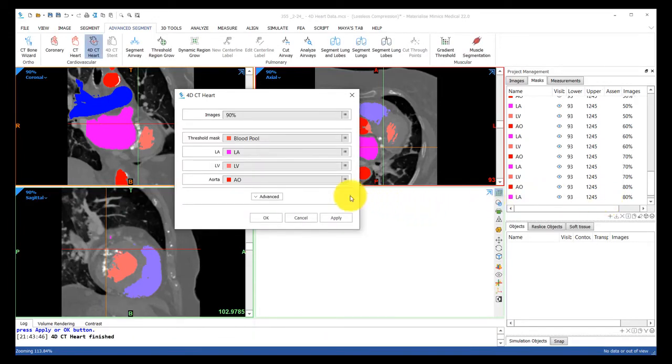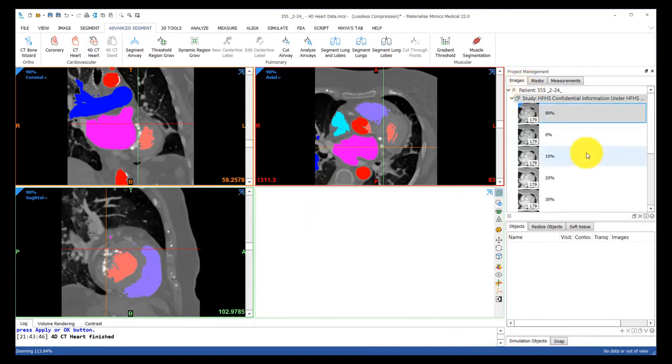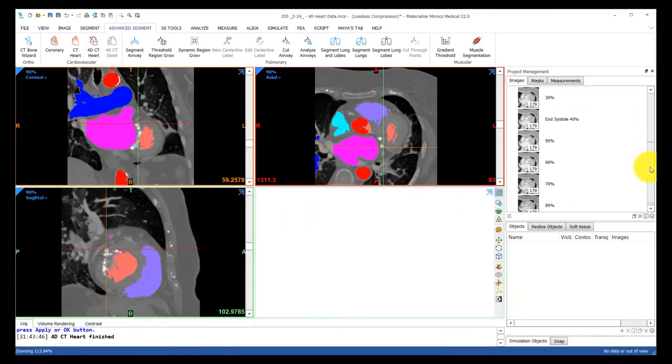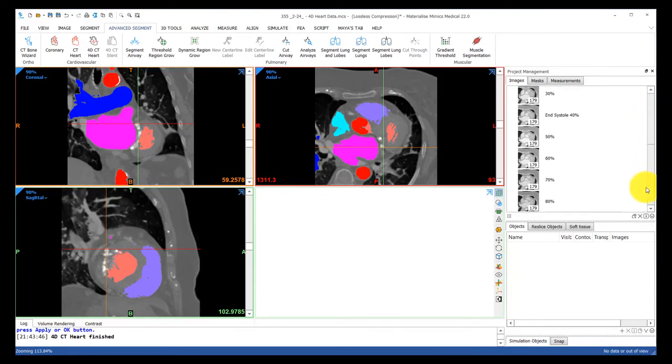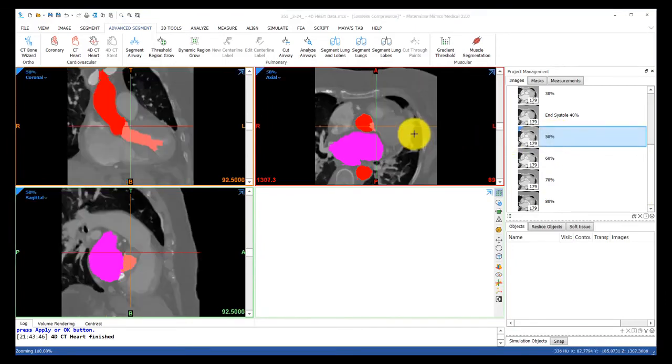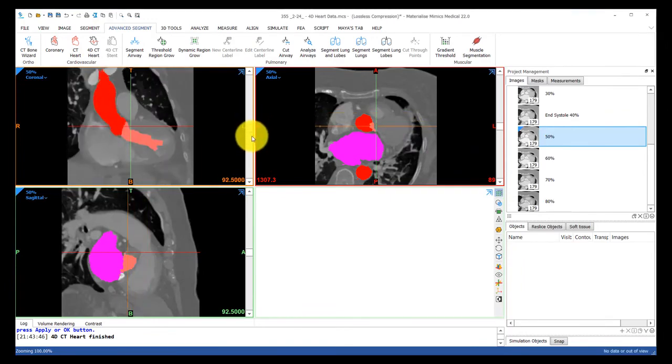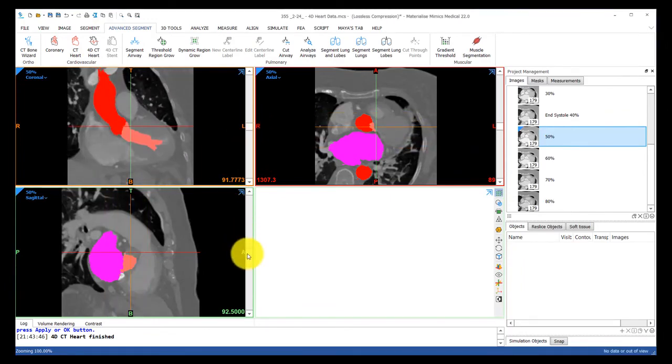Now that the tool has done its job, I'll head over to the images tab and let's choose any one of these CT stacks. So let's use 50%. I'll drag that stack over the viewports, and this is where we can now scroll through to do that quick quality check for that phase.